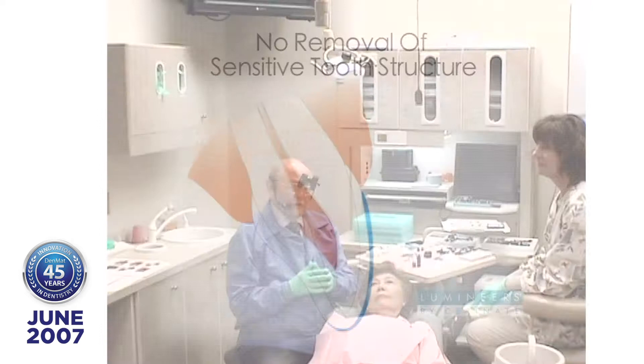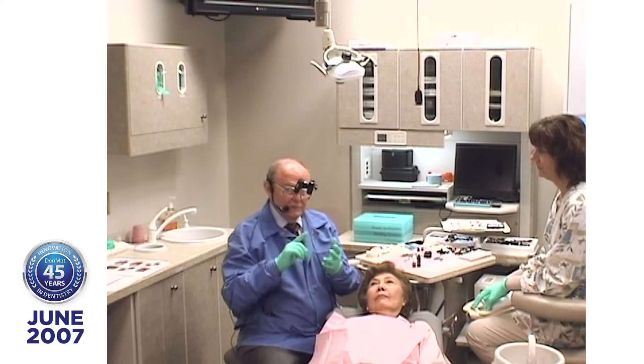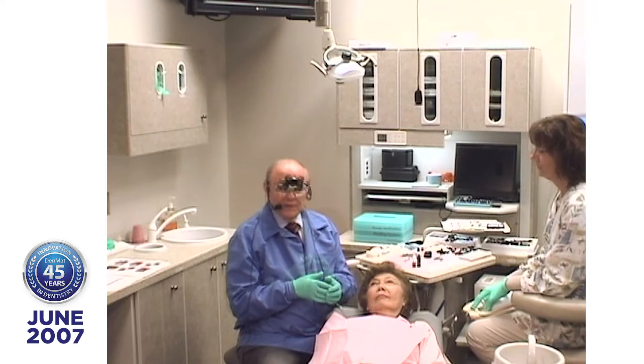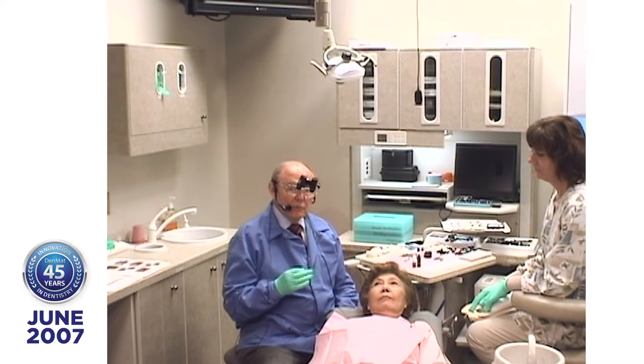When you have a patient in your reception room that you're giving a six-month check to after you're finished, they're caries-free, perio-free, and occlusion has been equilibrated. Do their teeth look really great or do they look natural for their age? Most of these people would like to look better if they knew they could get it done this way. What we're going to give patients is a conservative option to look better without the need to get any anesthetic and to remove any sensitive tooth structure. We're going to do that by not removing or creating a margin on her teeth, because she would not be sitting in this chair if I had to give her any anesthetic.